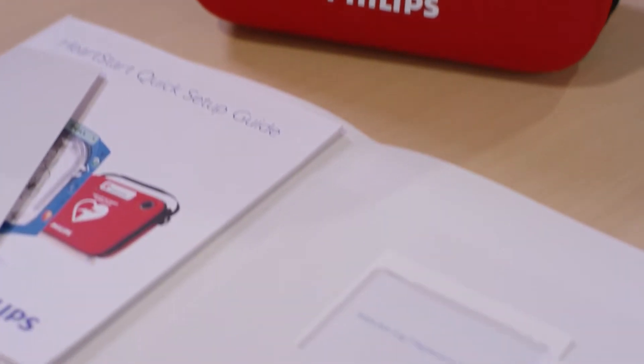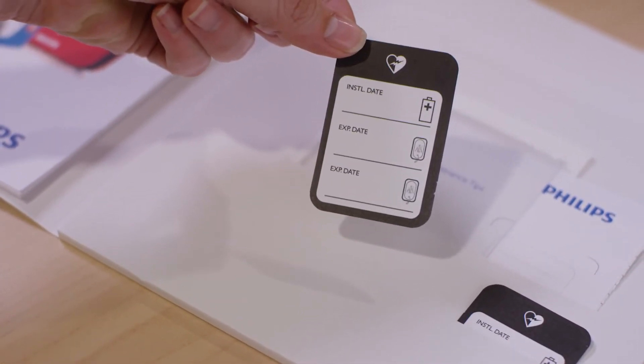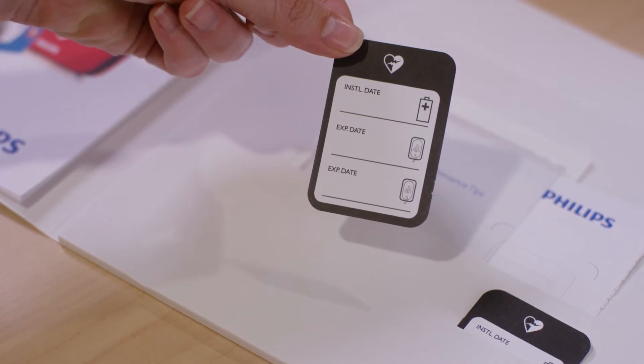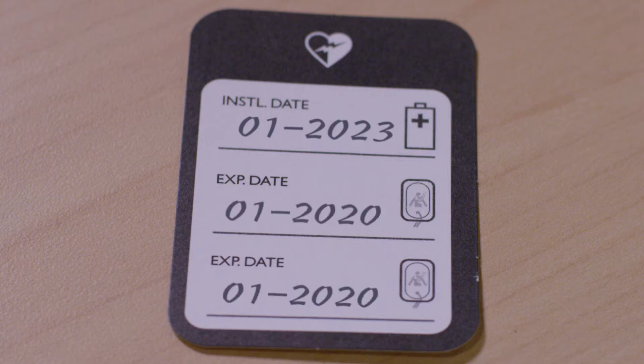Each system comes with a simple maintenance sticker to help you keep track of these two accessories. On this sticker, write down the key dates for your accessories: the install by date for your spare battery and the expiration date for your pads. Keep in mind that the date on the battery is not an expiration date — it represents the latest date the battery should be installed into the device in order to ensure full battery life.